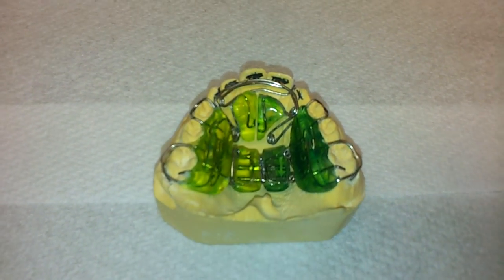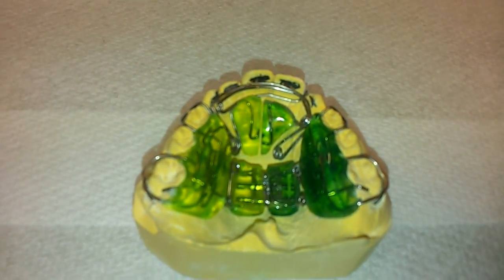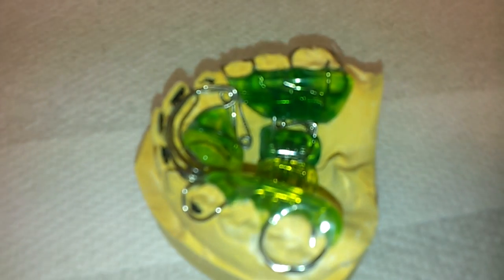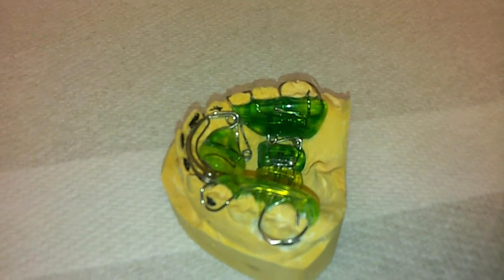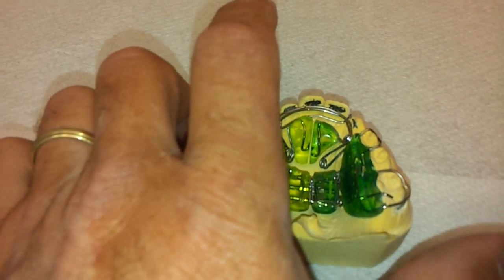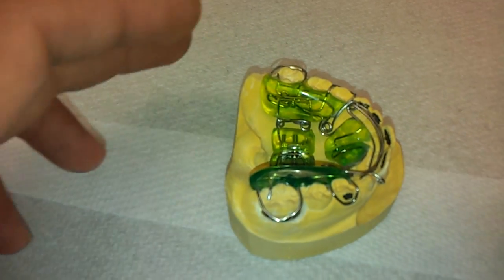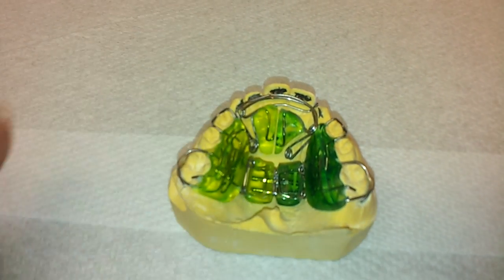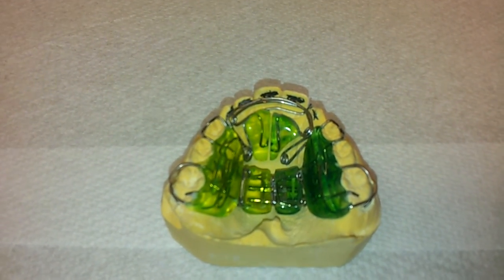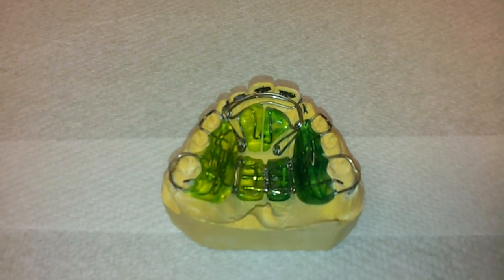Here we have a springy block. As you can see, the bulk is similar to that of a bioblock, except we've got some coil springs in the lateral walls of the appliance — one on either side — and we've also got some coil springs on the sagittal section of the appliance, so that we can advance the pre-maxilla forward at the same time as we are developing the lateral aspects of the mouth.